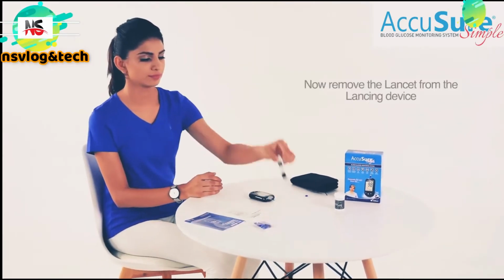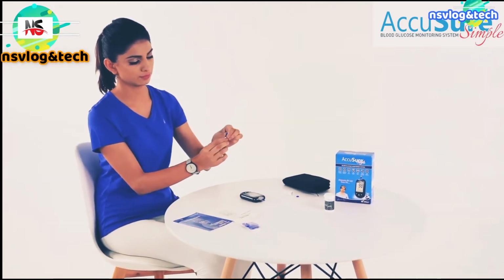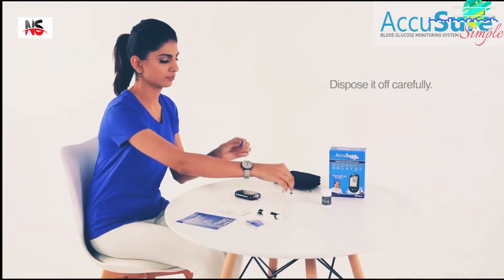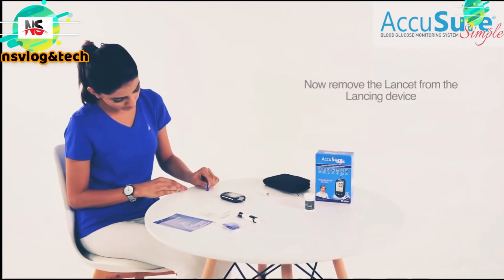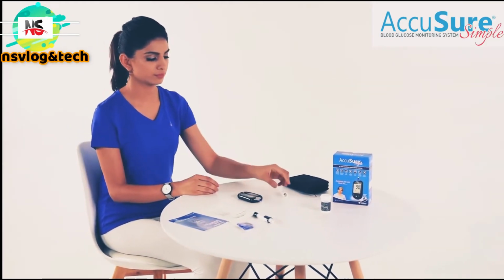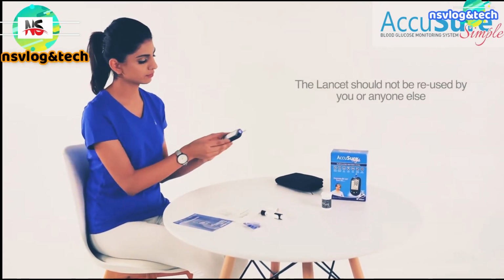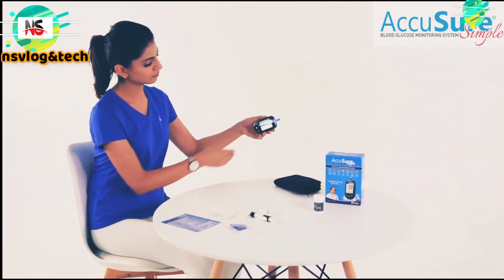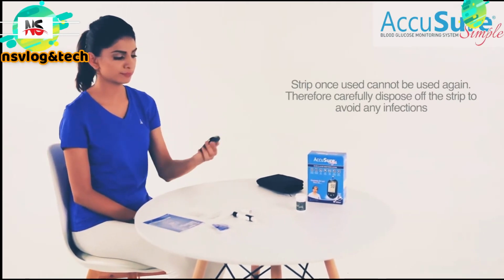Now remove the lancet from the lancing device and dispose it off carefully. Strip once used cannot be used again. The lancet should not be reused by you or anyone else. Therefore, carefully dispose of the strip to avoid any infections.